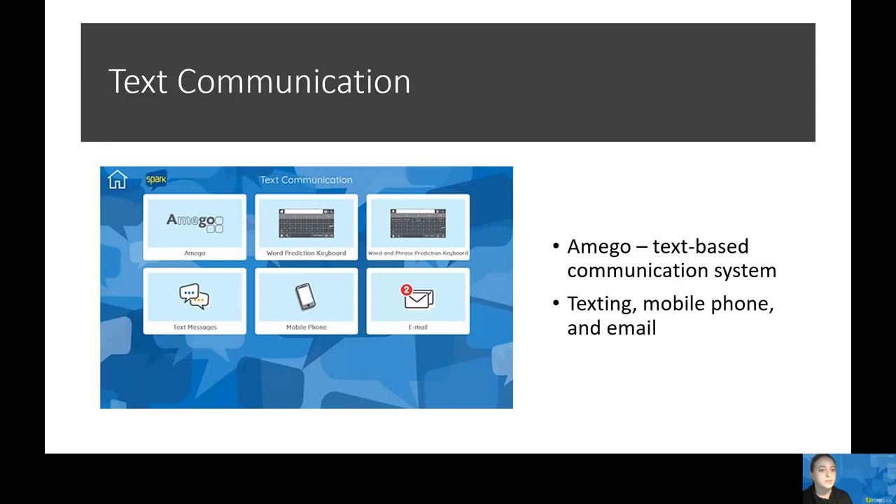First, we have Amigo. This is a text-based communication system. It includes a keyboard, custom phrases, contacts, phone calls, email, calendar, different games, desktop control, music, video, and more. On top of that, you can personalize it by choosing a different color scheme, modifying the start page, and changing the access method directly as well as the keyboard layout.